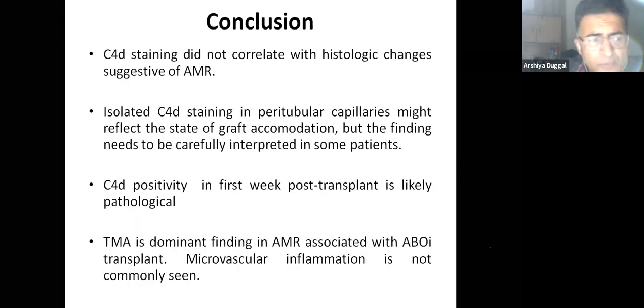To conclude, what I want to highlight is that C4D staining does not correlate with the histological changes suggestive of acute AMR. Isolated C4D staining in peritubular capillaries might reflect the state of graft accommodation, but the finding needs to be carefully interpreted in some patients. If there is isolated C4D staining, this could be related to graft accommodation. But if the histomorphology shows diffuse TMA, severe ATN, with or without microvascular inflammation, you have to think that it could be related to acute AMR.